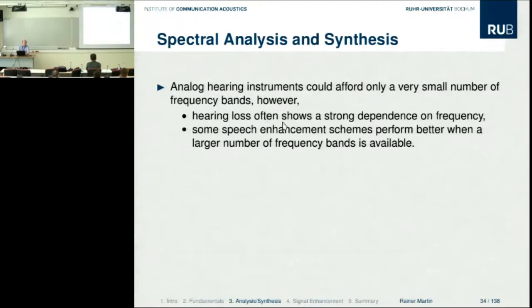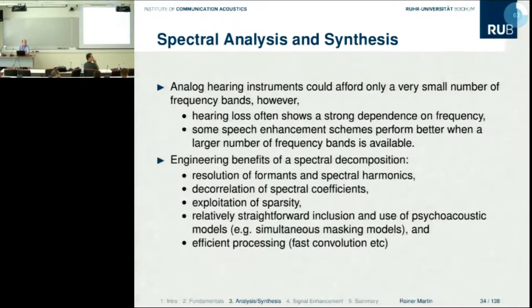But as we have seen, hearing loss often shows a strong dependency on frequency. And also we know that some enhancement schemes perform better when you have a larger number of frequency bands available. From the technical point of view, there are, of course, a lot of benefits which I don't need to explain in much detail, because also Yannis has talked about the properties of speech signals quite a bit yesterday.